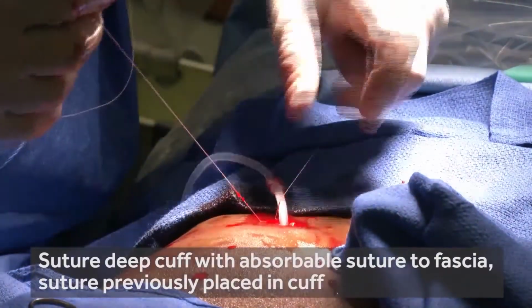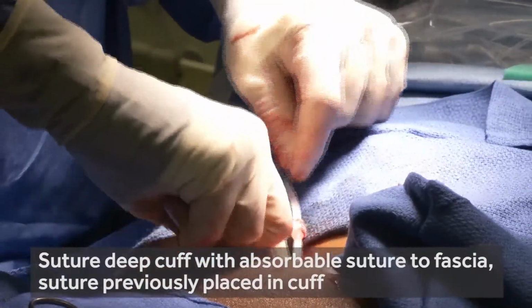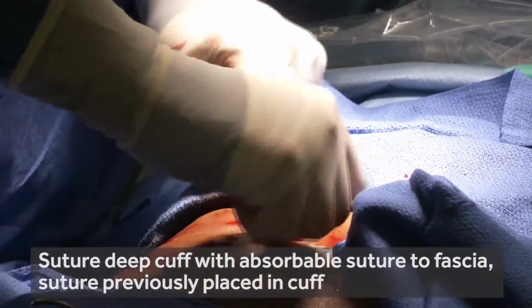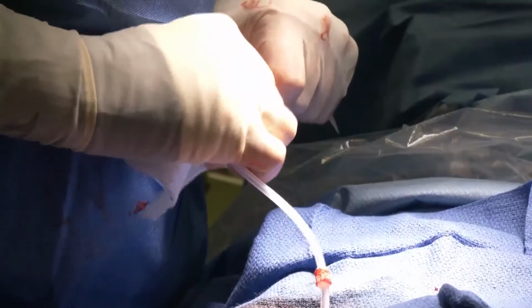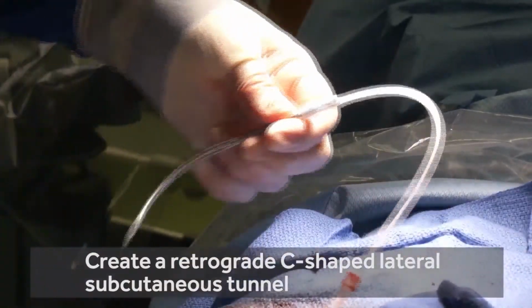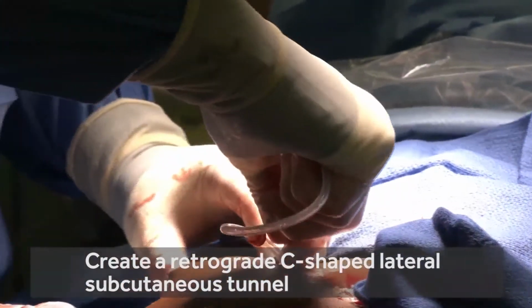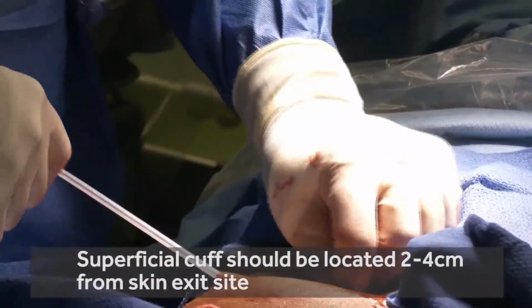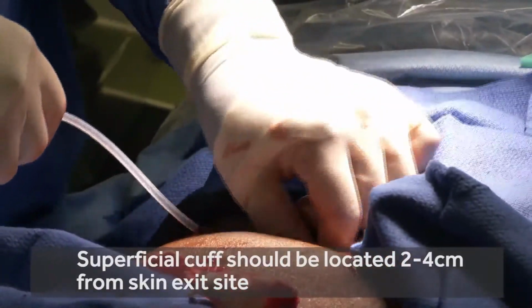And there won't be any sutures at the exit site. Everything is internal, and this is an additional guard against infection. And attaching the trocar to the catheter, now down the tract that has been previously anesthetized with lidocaine. And you can see that distal cuff, which we want 2 to 4 centimeters within the skin from the site of exit, and this is to prevent infection.